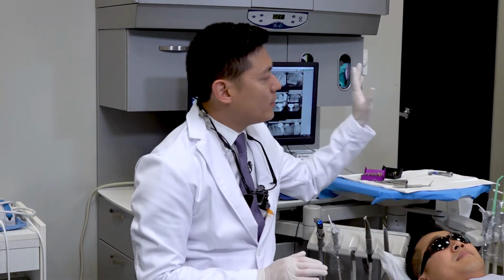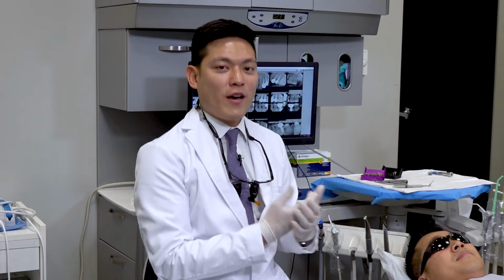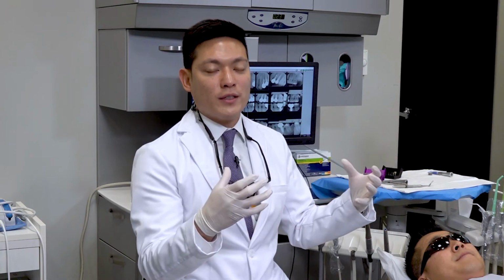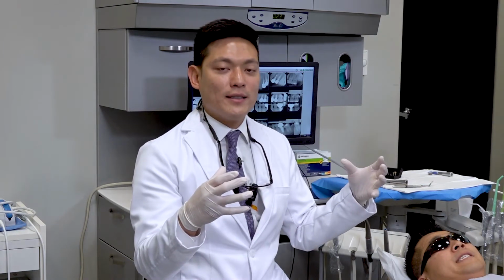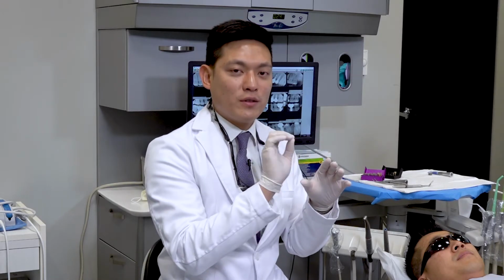Now we have our digital model. So we first want to ensure that on the quadrant model of the prep, in this case it's the lower, and the quadrant model of the opposing, that you have a lot of data of the adjacent teeth, of most of the teeth that you're scanning or around the area that you're working on, so that the system can visualize and match those same data points during the bite registration scan.